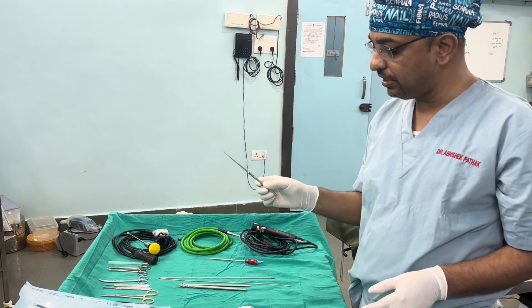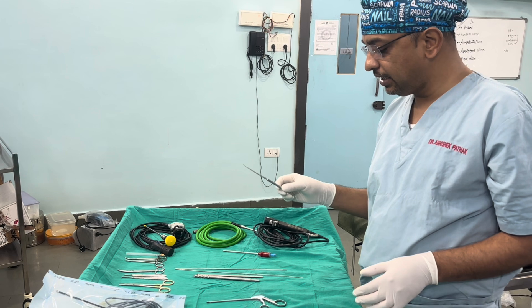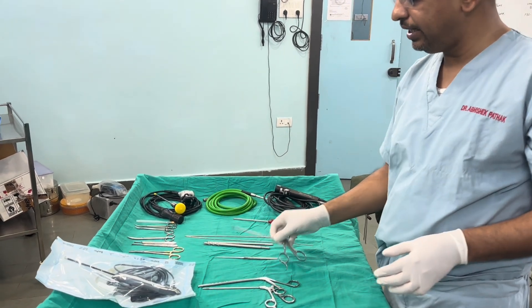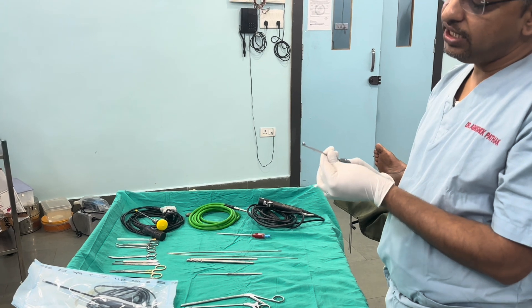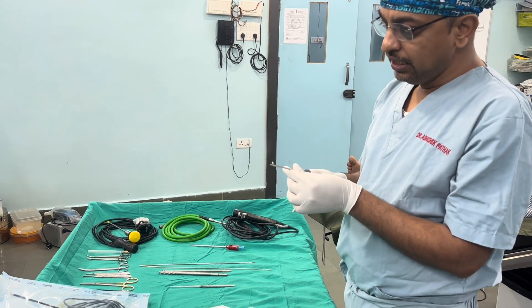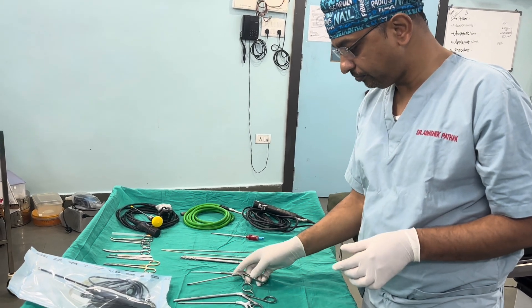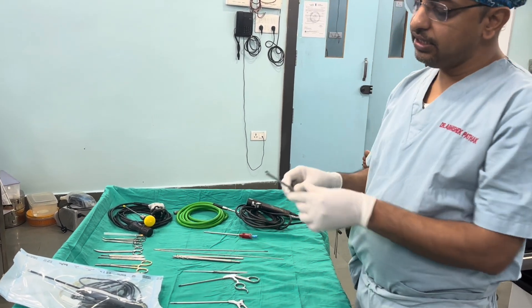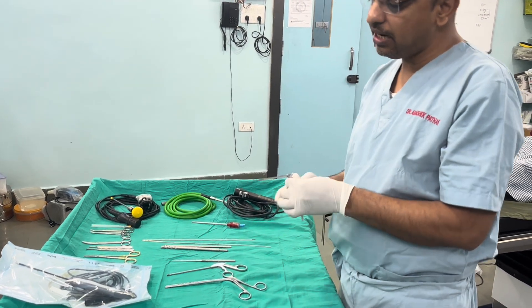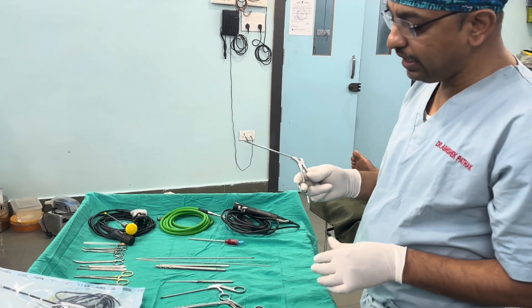The probe is the extension of your finger and is used to probe structures and look for continuity inside the joint. Then there is the 4.5mm punch, used for cutting torn structures and debriding. The grabber is used to grab things such as a loose body inside the knee joint and remove it.